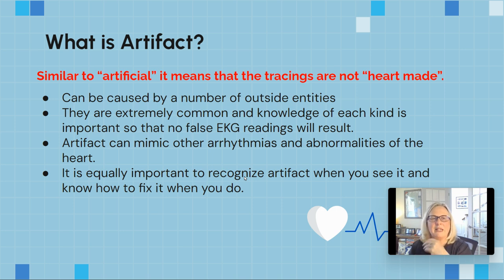So it's typically easy to figure out. You just want to make sure that you don't have artifact when you've printed it out for your cardiologist or whoever's reading the EKG, because they don't want a false reading on the EKG. They don't always know it's just artifact, okay? Because it can mimic arrhythmias and other abnormalities.